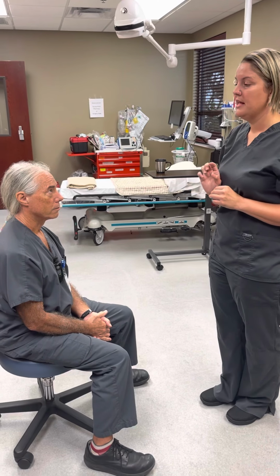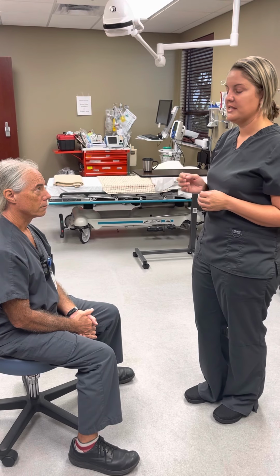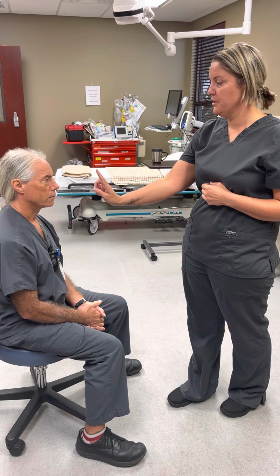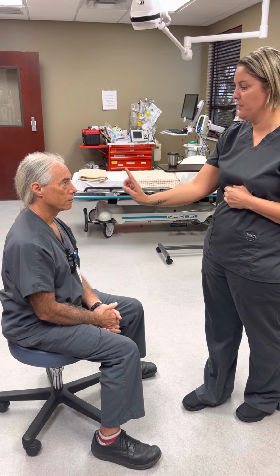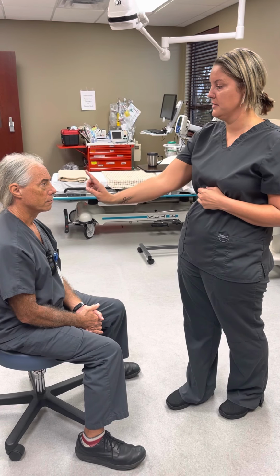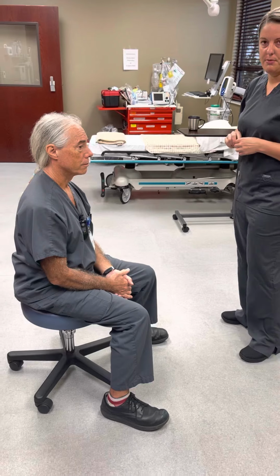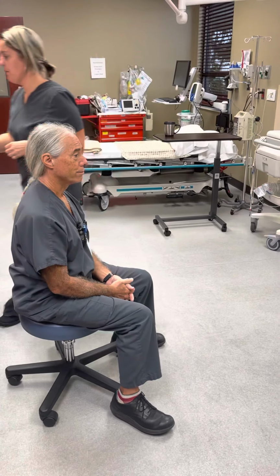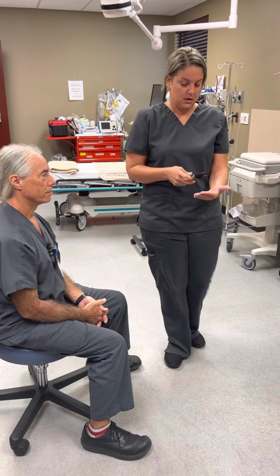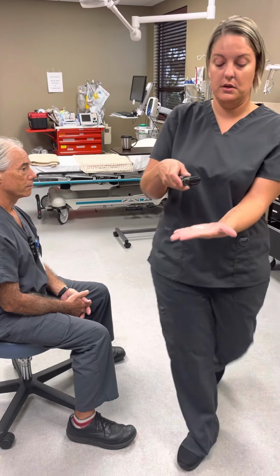Okay, and then that is just the cardinal directions of gaze, and then we'll test for convergence, where you're going to follow my finger to your nose and you're watching their eyes and make sure they both follow your finger, and then their pupils also will constrict, and that is convergence and constriction. Okay, and then we're going to use the ophthalmoscope, which is this. Turn it on, and then you'll just have a light, which you can see.